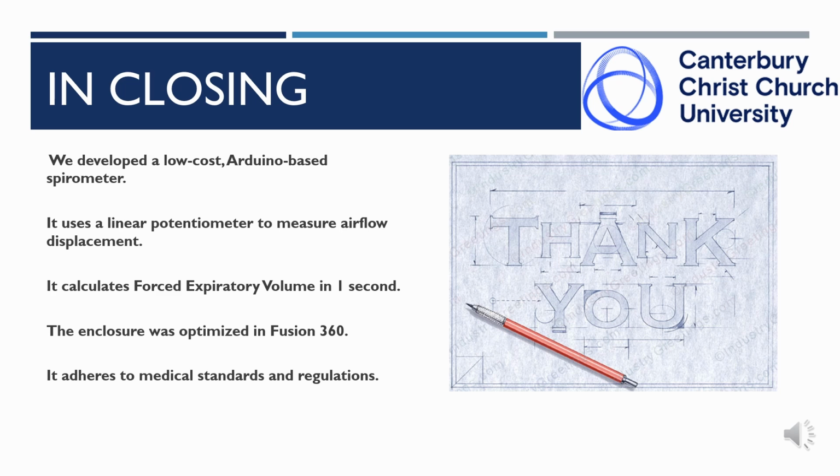The integration of wireless data transmission and smartphone connectivity in future iterations will further enhance its usability, allowing for remote patient monitoring and real-time data analysis. Moreover, ensuring compliance with ISO, BSI, and EU medical standards will make this spirometer a viable alternative to commercially available high-end spirometers, which remain out of reach for many patients worldwide.